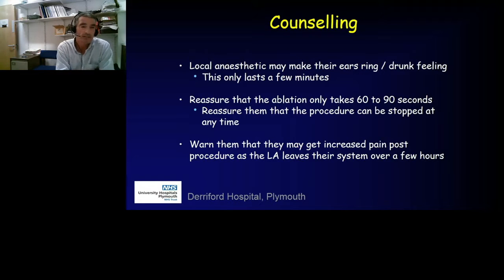As part of that written consent with the counselling, I think it's important to note that with the local anaesthetic that they get, the uterus is quite a vascular organ, so it gets into the bloodstream quite quickly, and so sometimes they complain of their ears ringing or a slight woozy feeling of the head, which is very short-lived, but if the patients are expecting it, then they don't worry.